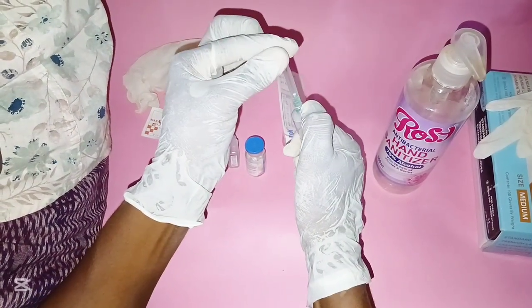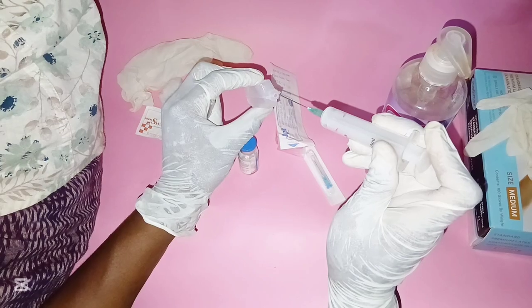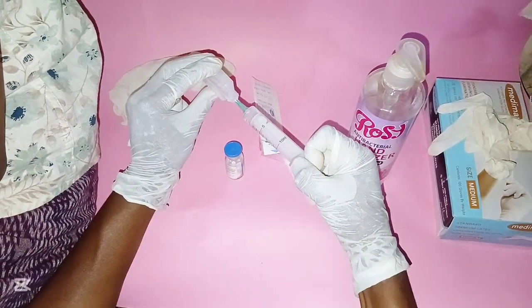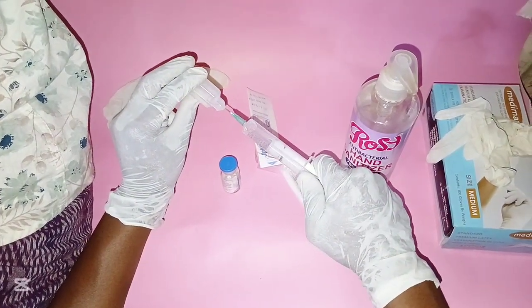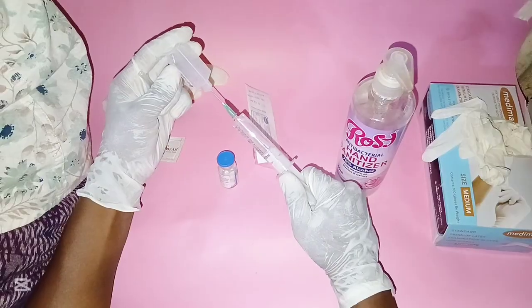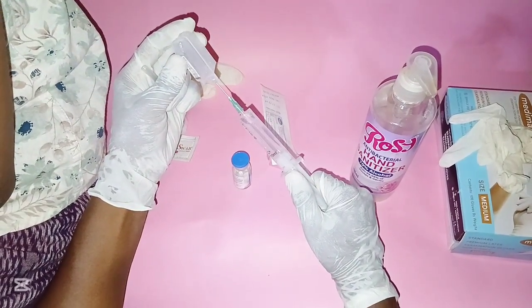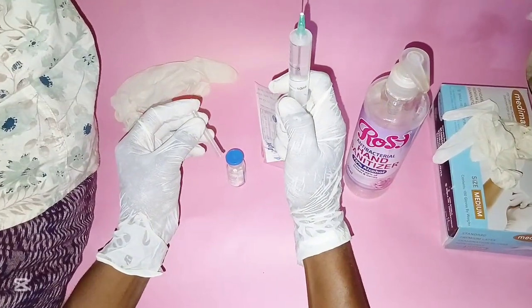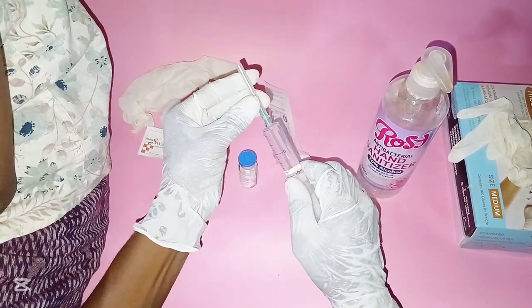Get the syringe together with the needle, remove the cap of the needle, insert the needle into the plastic vial, and withdraw all the sterile water for injection. Remove any air bubbles from the syringe, then recap the needle.